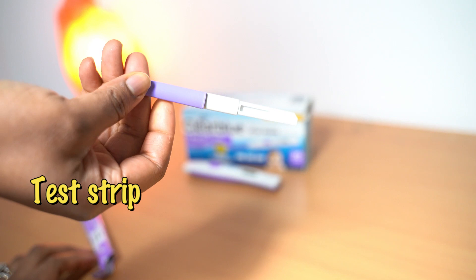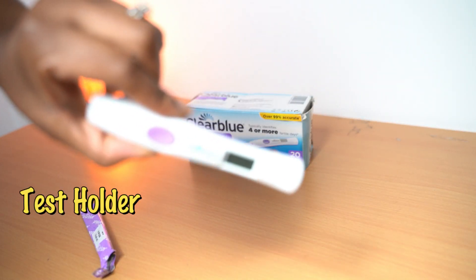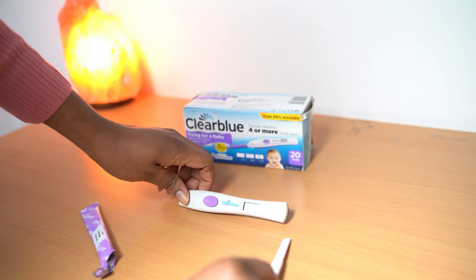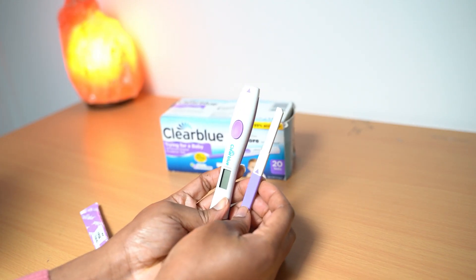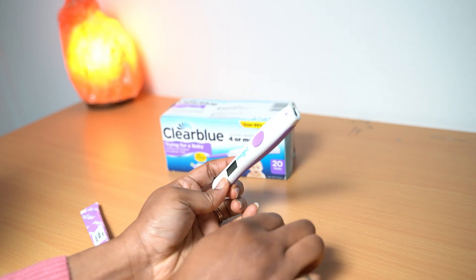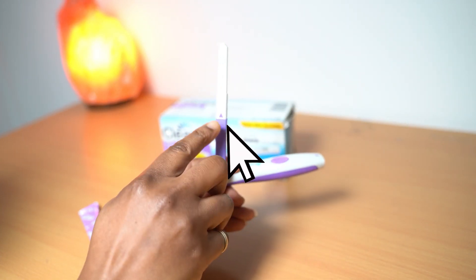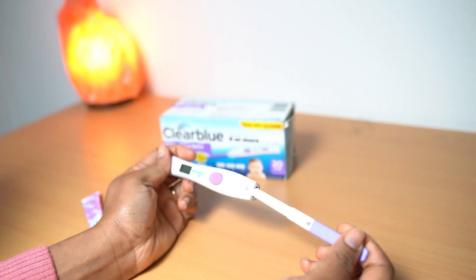So this is what the strip looks like, this is what the holder looks like, and this is the pack. This is the strip and this is the holder. You want to make sure that this arrow here and this arrow here on this one are going to be opposite each other.